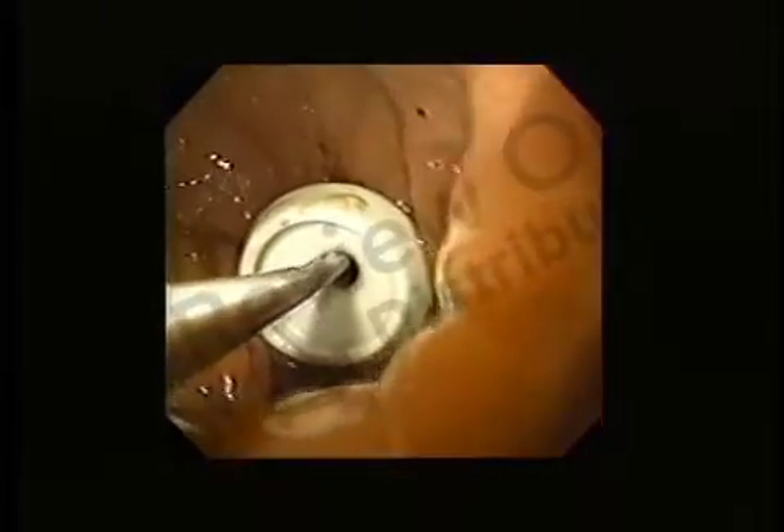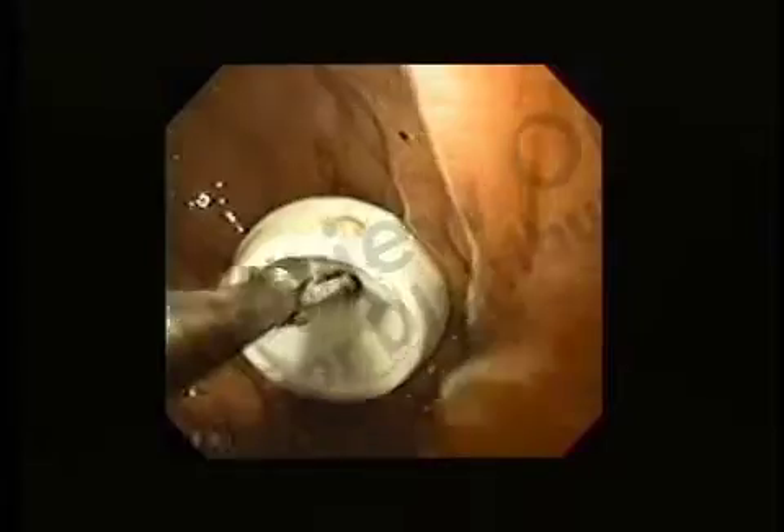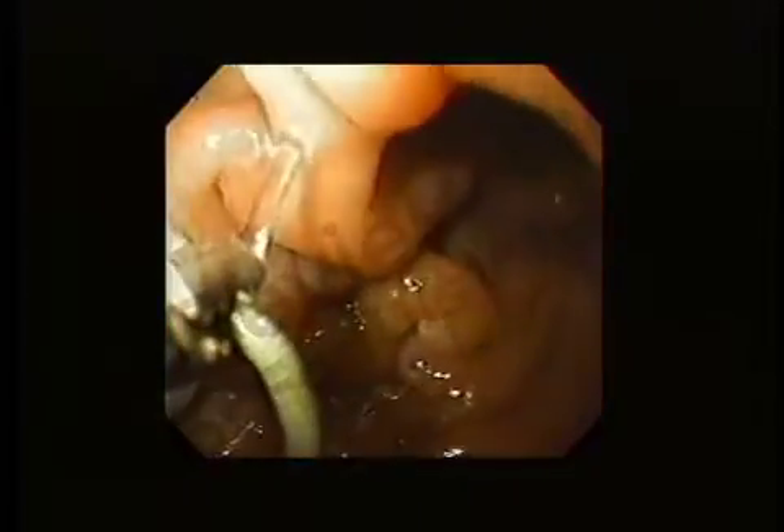Once the air plug is secure, use the gastroscope to insufflate the stomach. This will provide better visualization of the antrum and pylorus. Advance the gastroscope with wire guide and forceps through the pylorus and into the second portion of the duodenum. Straighten the wire guide by holding it tightly at both ends, then advance the wire guide and forceps to the third portion of the duodenum.